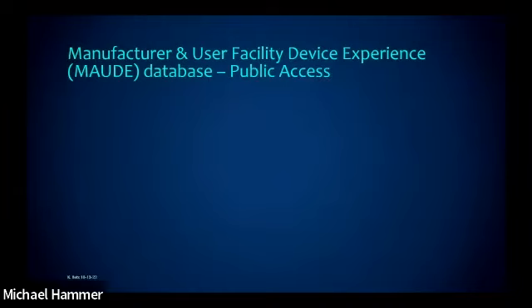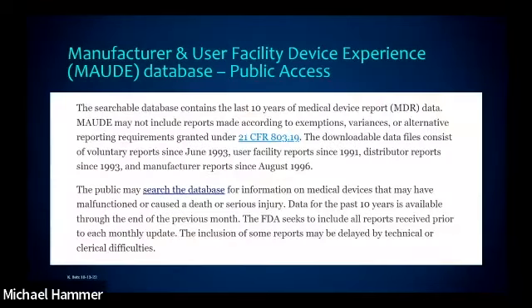In the US, again, part of the FDA regulation of devices, we have the Manufacturer and User Facility Device Experience database. So now we're moving into, everyone has a responsibility and opportunity to report adverse incidents. What data is readily available to you? It's all at your fingertips. This is public information. Most folks just don't know about it. So we refer to it as the MAUDE database. It is public domain. You can go to fda.gov, plug in MAUDE, M-A-U-D-E. Anybody can search the public database for information that you are looking for about adverse events.